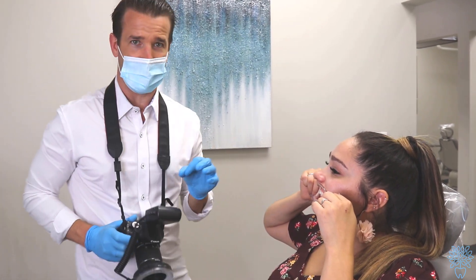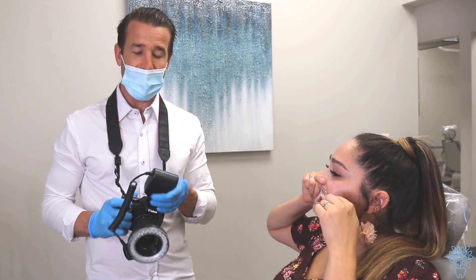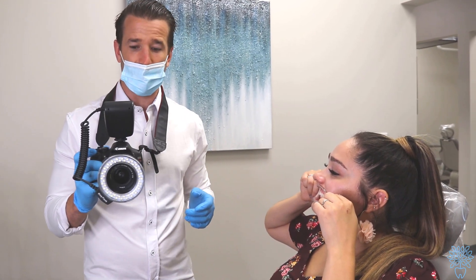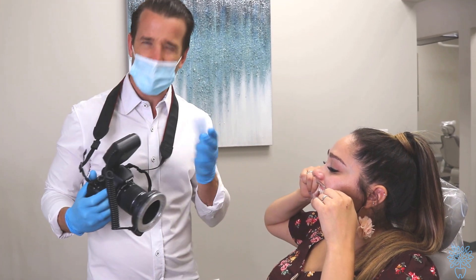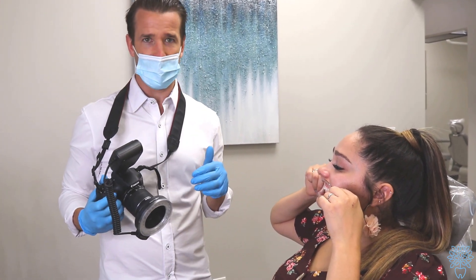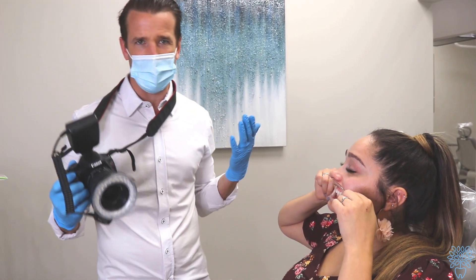Go to the M function — manual, mouth function, whatever you want to call it — turn on the flash, and be about a foot and a half away from the patient. That distance gives us the best pictures and everything turns out great.